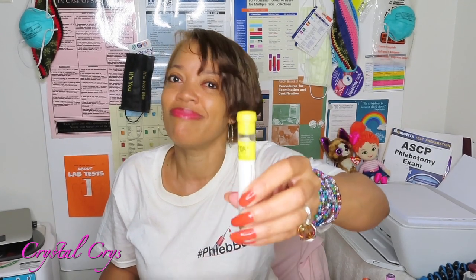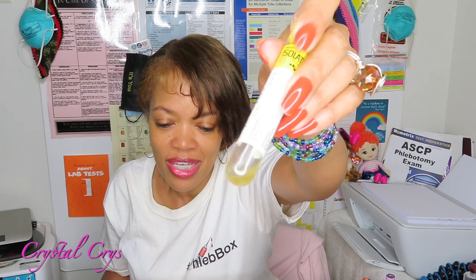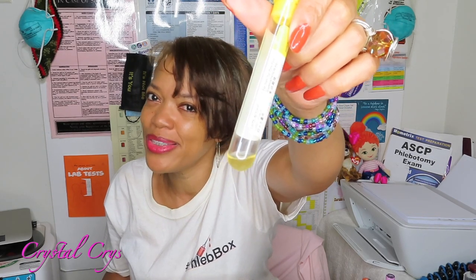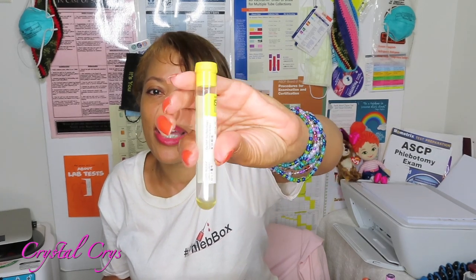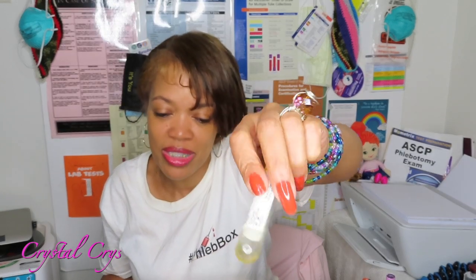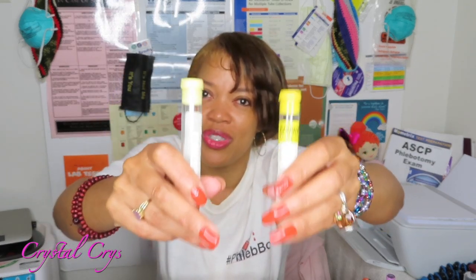This is your sterile yellow top tube — it is a blood culture tube. The additive is SPS. It's going to yield whole blood. See that little liquid in the bottom? You've got to invert it eight to ten times and make sure it mixes well, same as blood culture bottles. We've got to make sure the additive is mixing with the blood so we're not compromising our specimens. It goes to microbiology. Do not confuse this tube with your non-sterile yellow top tube.